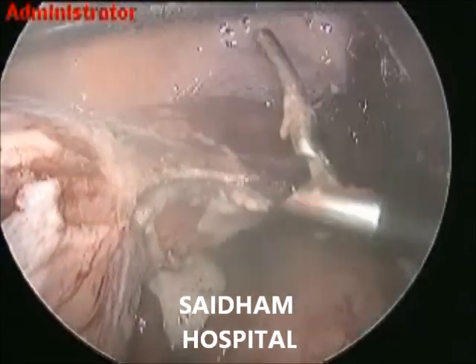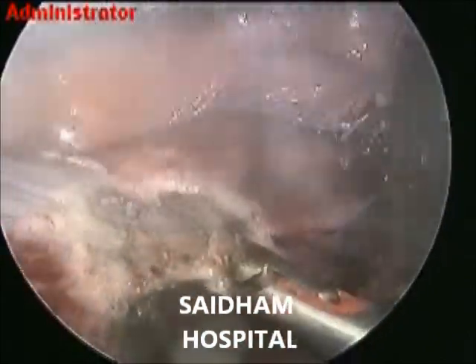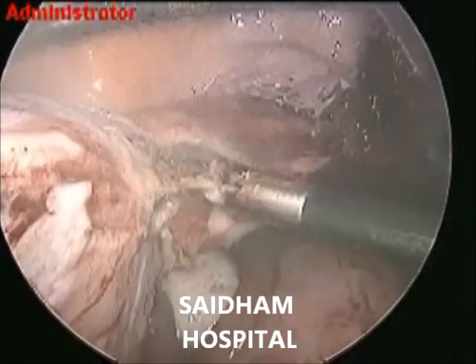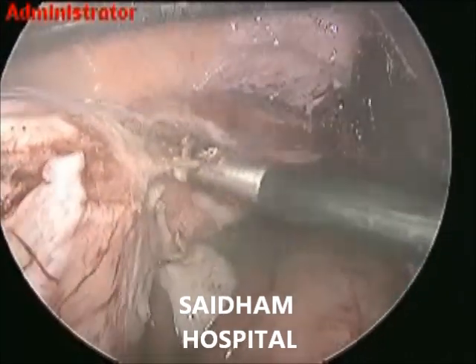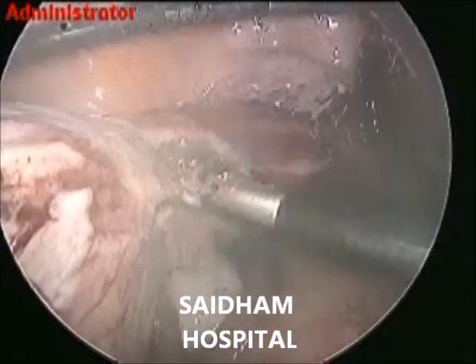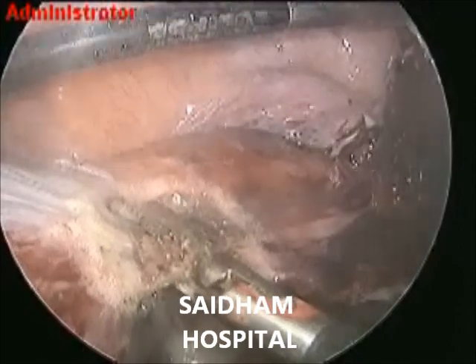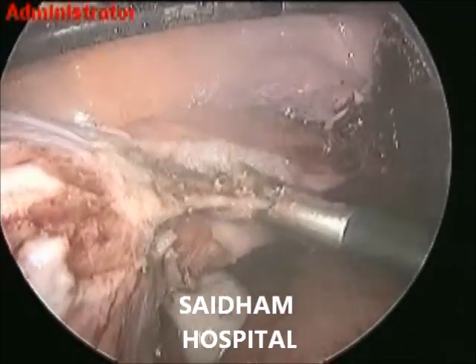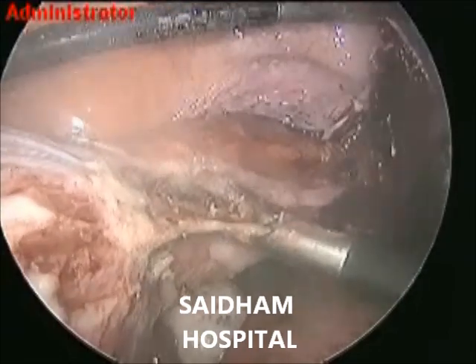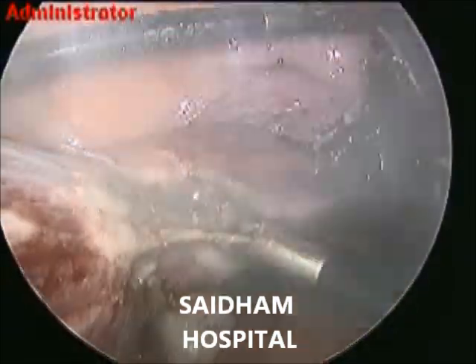The posterior lip of the broad ligament is totally cut. Now some accessory fibers of the broad ligament and accessory fibers of the UV fold are being cut. The cutting of the utero-sacral is the most important step as the ureter is lateralized. The effort is going on to coagulate the uterine artery on the right side. Full coagulation, as I said, is very important.